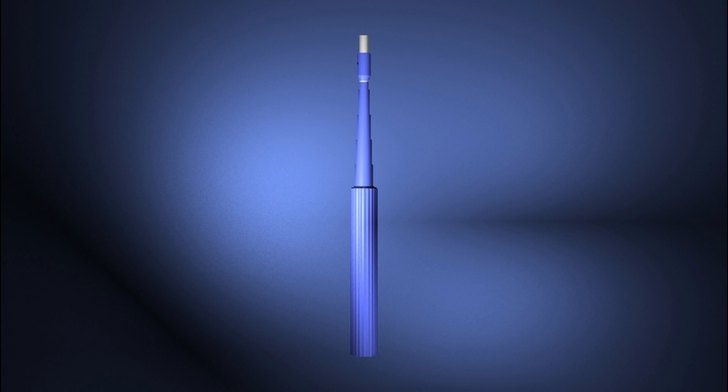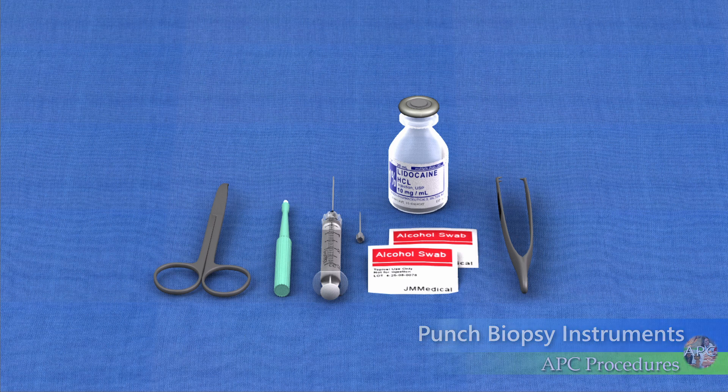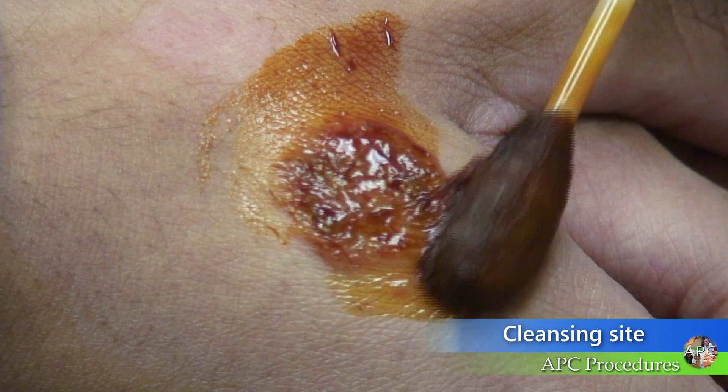In this procedure, the punch biopsy instrument is used to obtain a full thickness cylindrical specimen. Punch biopsy is a good choice for complete removal of small lesions less than 5 mm, or when there is doubt as to the diagnosis or optimal treatment of a particular larger lesion.